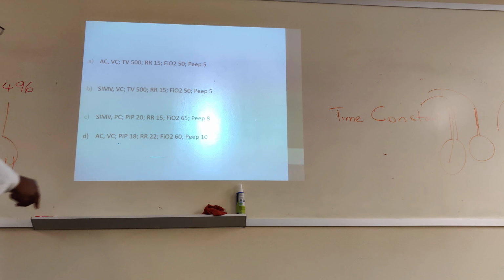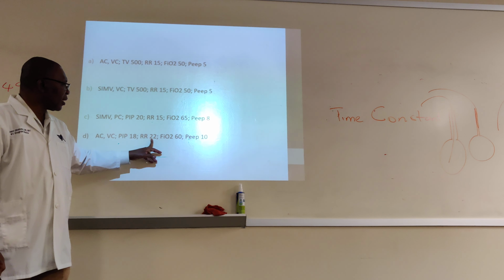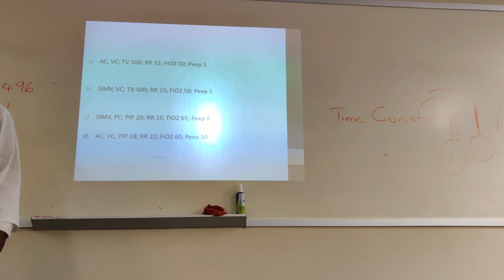So, pressure here is fine, respiratory rate is high, and by the way, we can do a PEEP of 10. You will never start with a PEEP of 10 initially, never, okay?